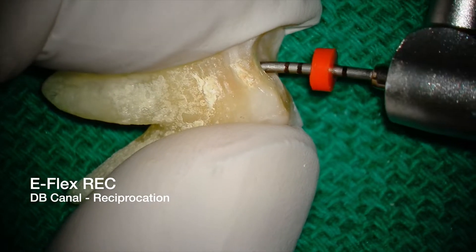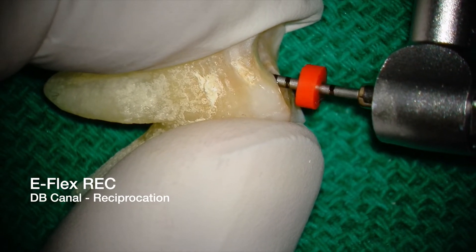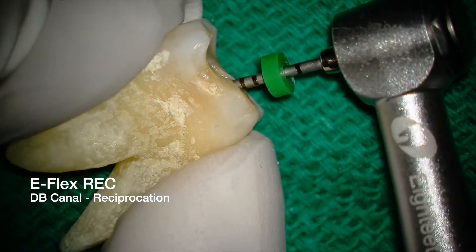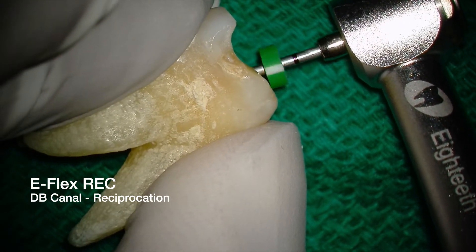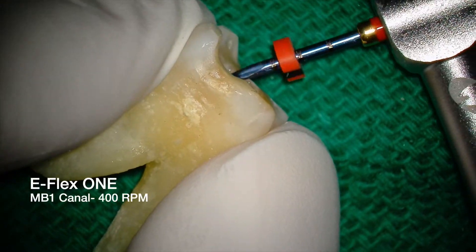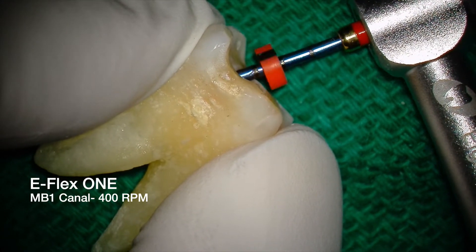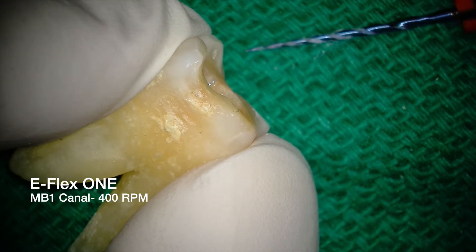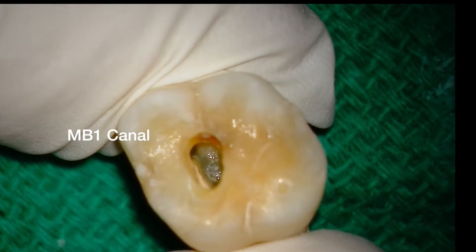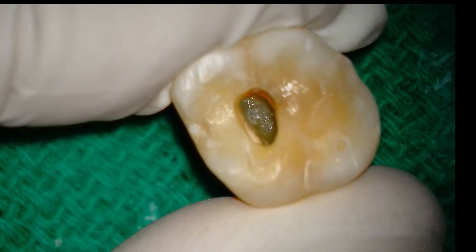First up, I'll clean and shape the distal buccal canal with the E-Flex REC up to a 3504 file. You may ask, hey Ash, why are you opening up to a 3504? Well, you're gonna have to stick around to the end of the video to find out. I'll use the E-Flex 1 file to shape the MB1 canal to a 3504. I'll be honest, this file is super smooth and it's really painful for me to say this as I love reciprocation. I'll clean and shape all the main canals before tackling MB2.